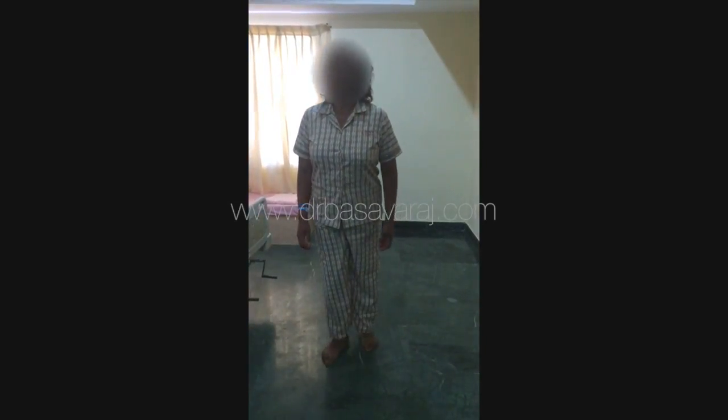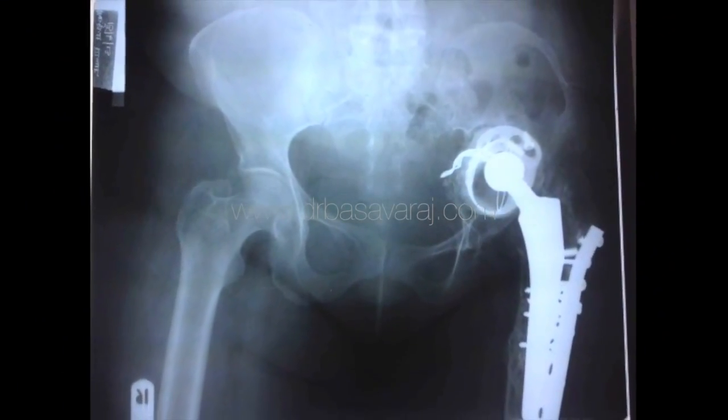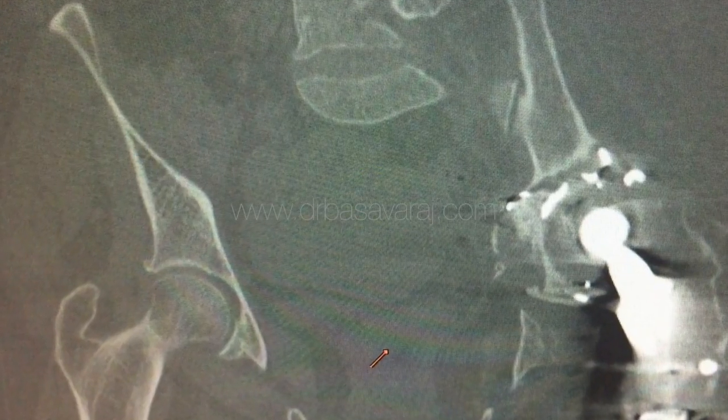We can see from the x-rays and scans that she had bone loss around the left hip prosthesis, with resulting loosening and migration of the components.